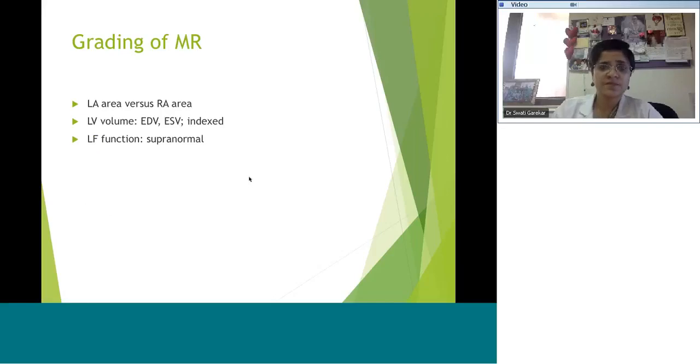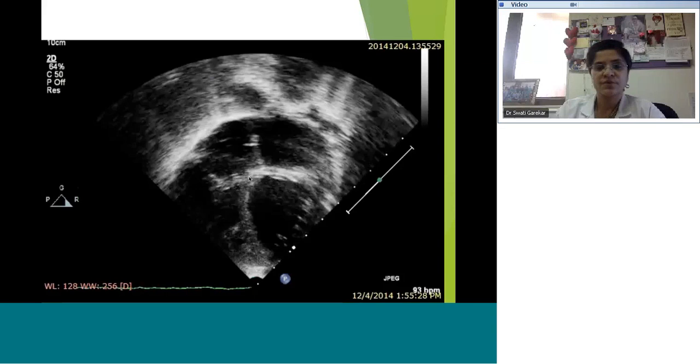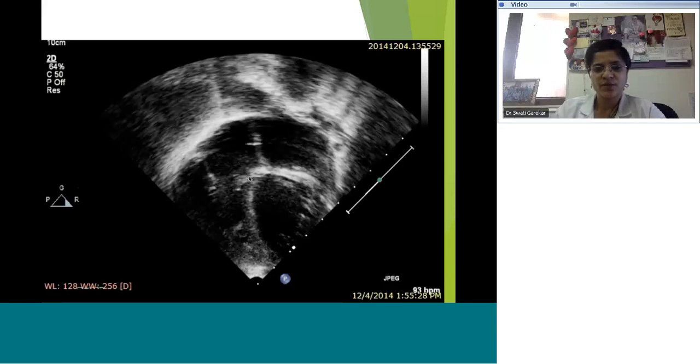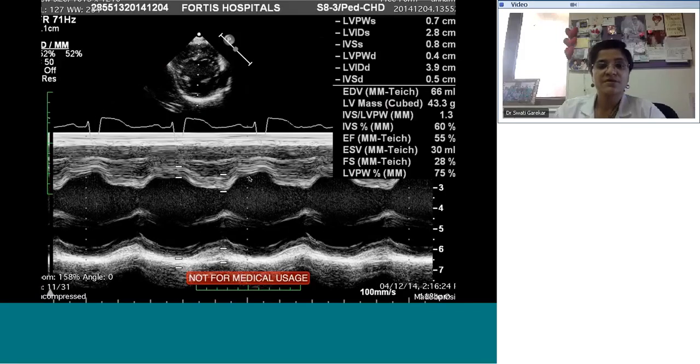So we covered this. One other thing I have not mentioned, but we will cover in the subsequent patient, is the importance of looking at the LV dimension. So this next patient is a 2-3-year-old. This is actually a postoperative patient. Four-chamber view. We don't like the way the interventricular septum is moving. Can't really see the mitral valve because we're not in the correct plane.